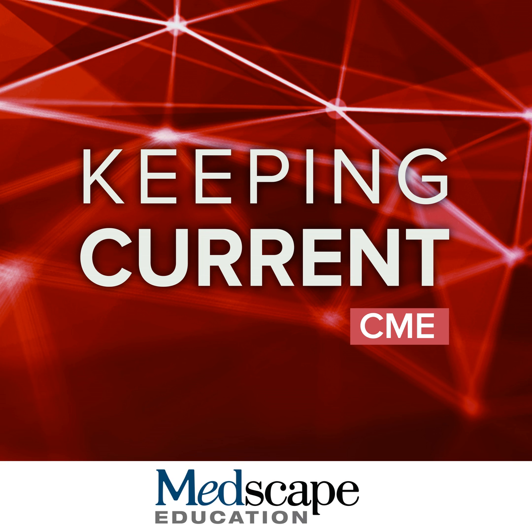And then if we move to case number 3, again, you can see akinesia and wall thinning at the apex and also involving the inferior wall. But I think what's most obvious here is the bulging from the inferior wall. So the inferior wall of the heart in this case is what's called dyskinetic. The wall is moving in the opposite direction to what it should normally be doing. There's also transmural enhancement in the wall. So this indicates that this patient has developed a true aneurysm as a result of their chronic infarction.